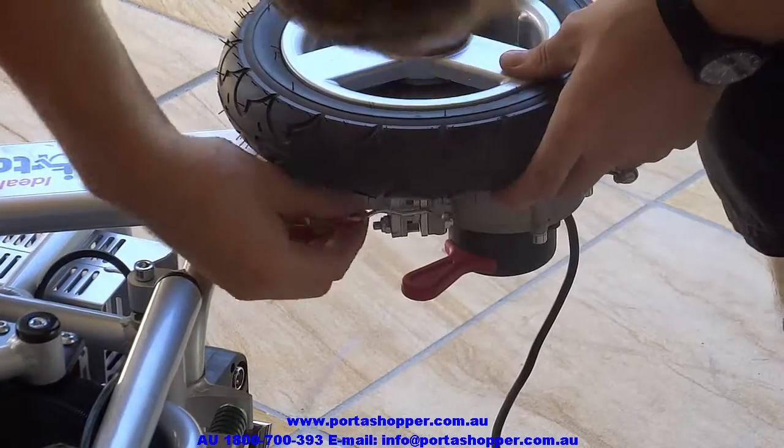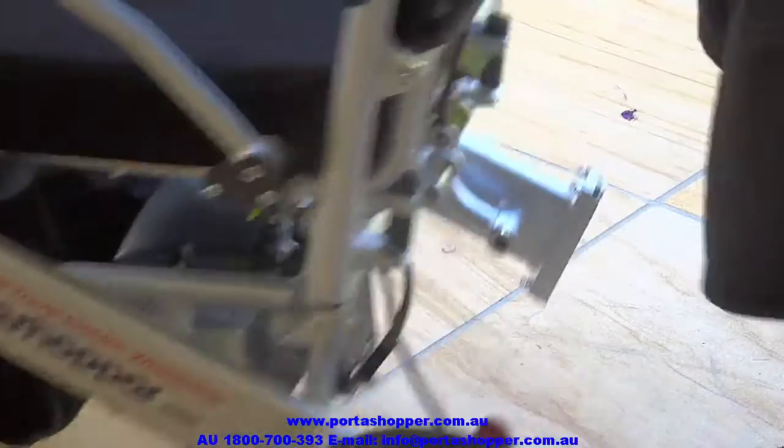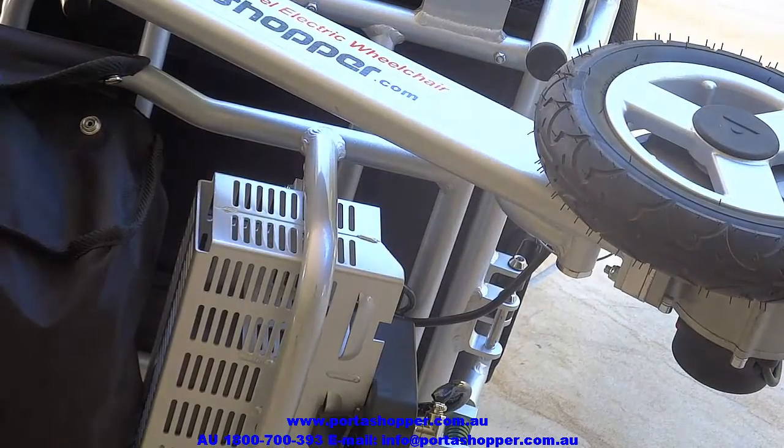For all the Portashopper Grand's improvements — slightly stronger motors, bigger wheels, more legroom, and more comfort due to an adjustable backrest — the Portashopper Grand still only weighs 25 kilos.